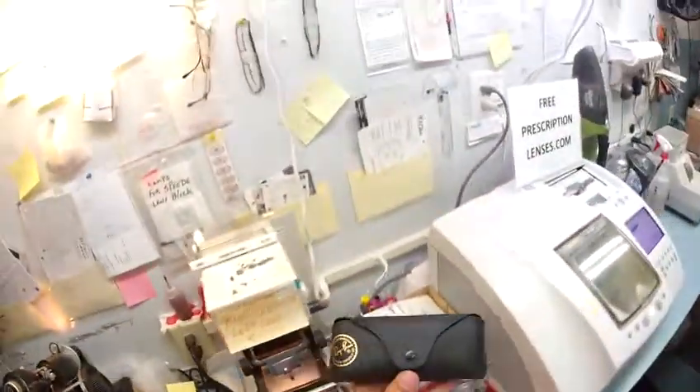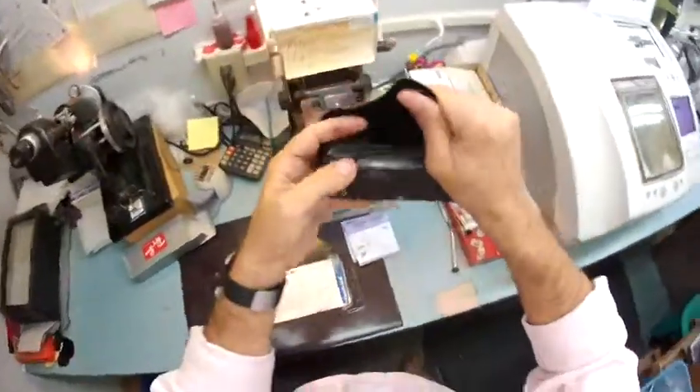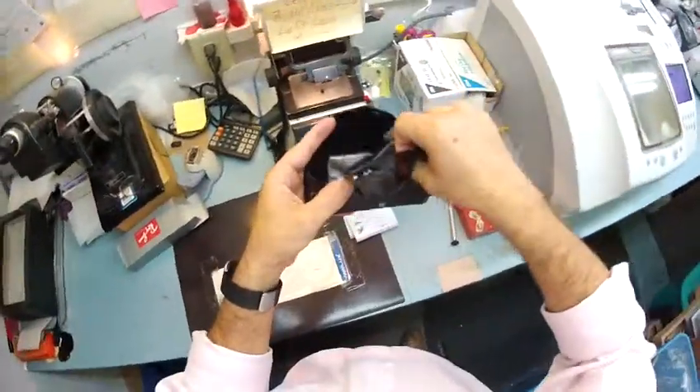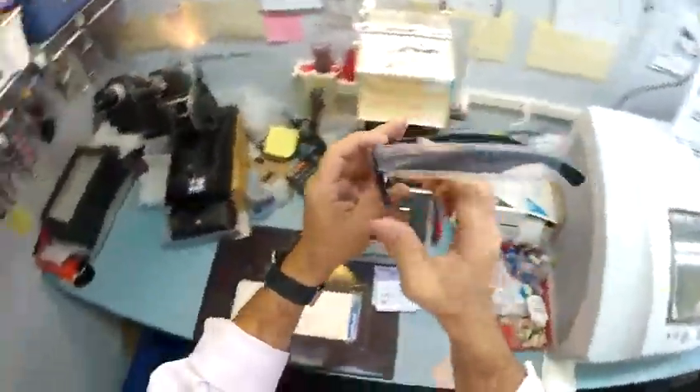I'm going to take your frames out of the original packaging. This is your Italian leather Ray-Ban New Wayfarer case — smells like Italian leather. Your Ray-Ban frames, your Ray-Ban cleaning cloth, and this is how Ray-Ban sends them to me, with the little plastic sleeve on the left temple.